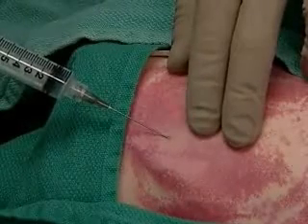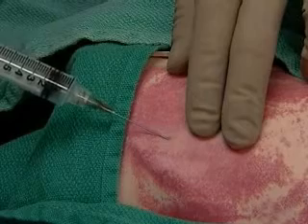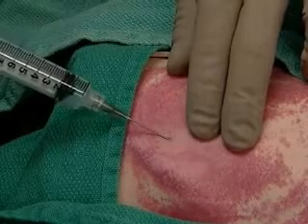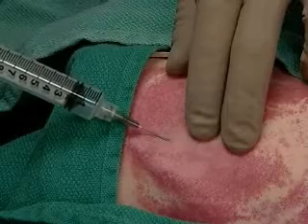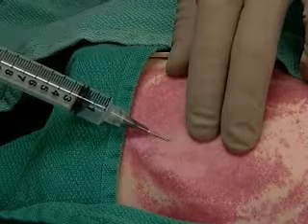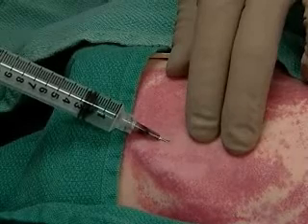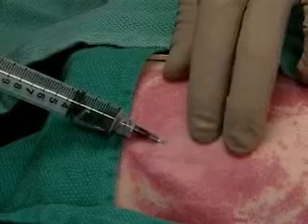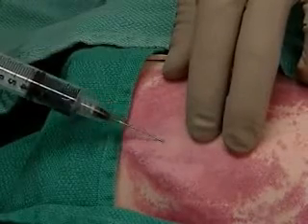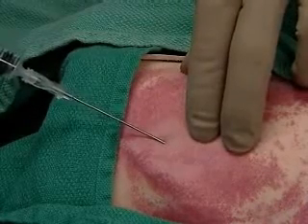Gently palpate the carotid and insert the finder needle in the point of the triangle, advancing slowly and staying lateral to the carotid. The trickle of blood shows we're in the jugular. You'll withdraw the needle, mentally noting the location and the angle of entry, and re-enter with the Seldinger needle.